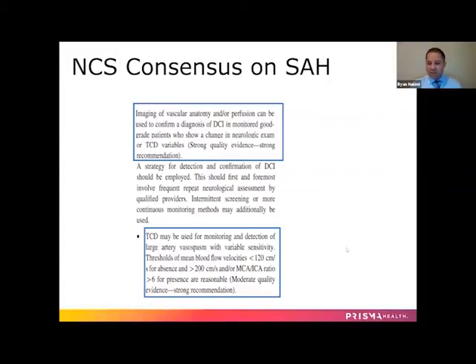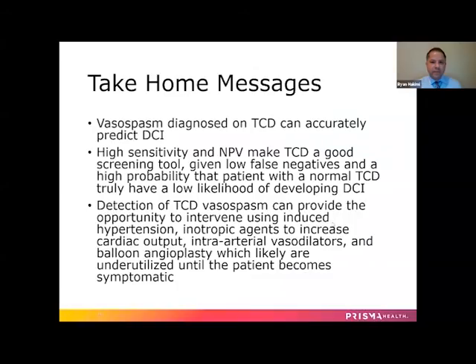However, if the patient indeed has severe vasospasm, that ratio will not be canceled out, and it will be elevated, indicating that the mean flow velocity in the middle cerebral artery is not proportionately elevated. It's astronomically elevated in comparison to that in the ipsilateral extracranial internal carotid artery.